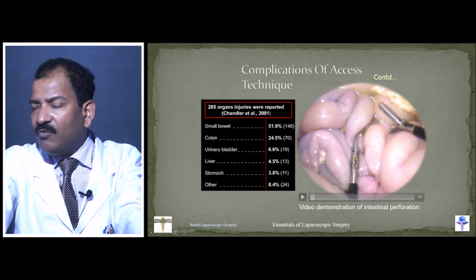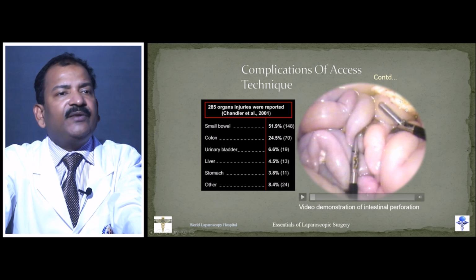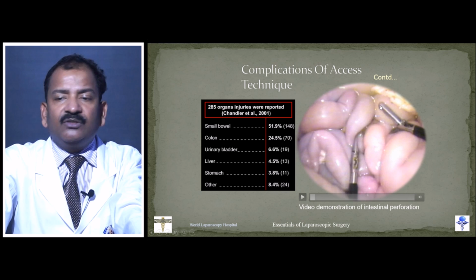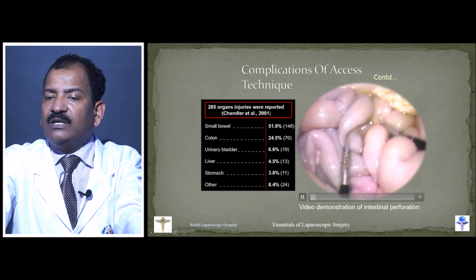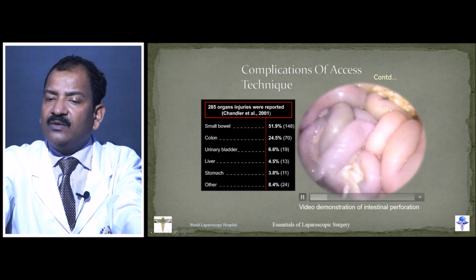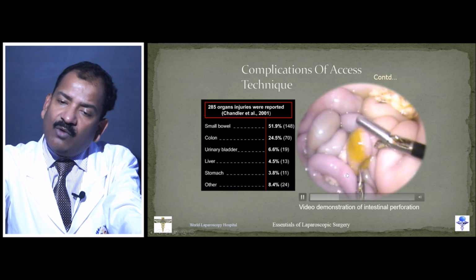Suppose you went inside the abdomen, and if there is any yellow area anywhere in any flank or quadrant, you should immediately be careful, and then do a little diagnostic work, like putting the bowel out, and try to find out, and here is the perforation. Now, what to do?